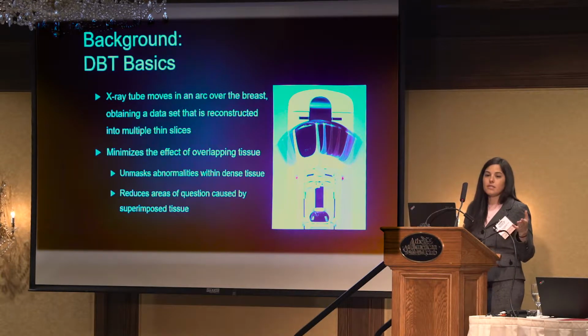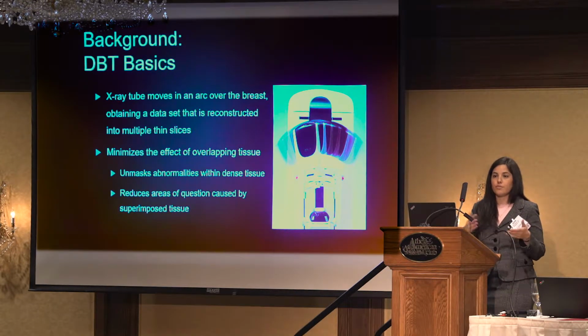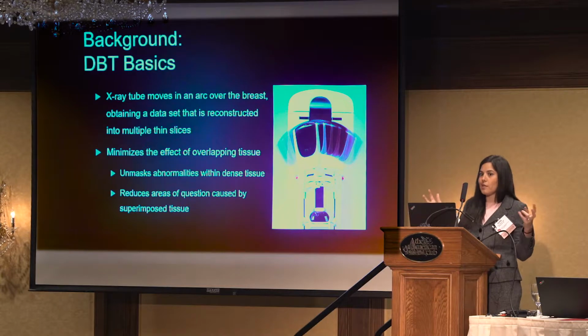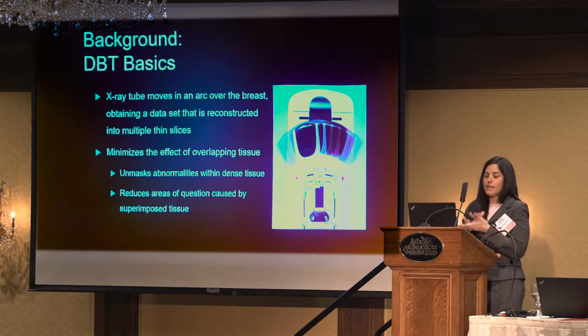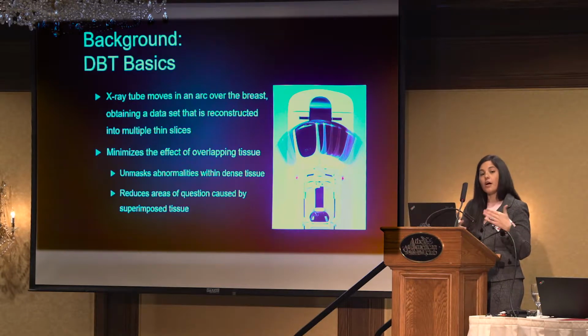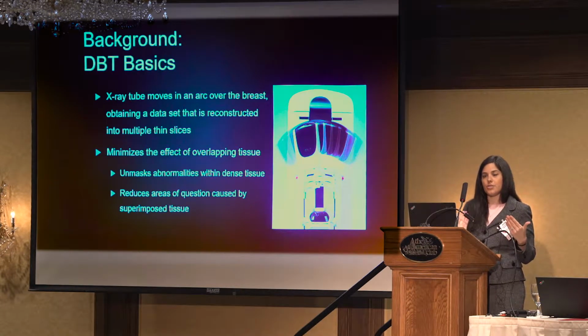These slices can be displayed, you can scroll through them, or you can view them as a cine. And really the benefit is tomosynthesis gives you a 3D-like look through the breast, which minimizes the effect of overlapping tissue. So in the case of breast cancer diagnosis, it could unmask a cancer hiding in dense tissue.